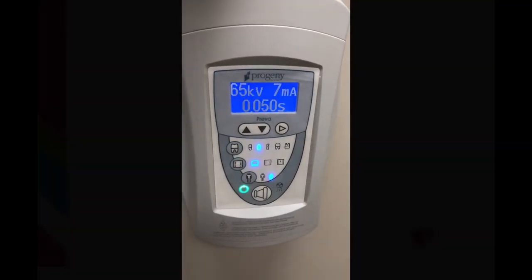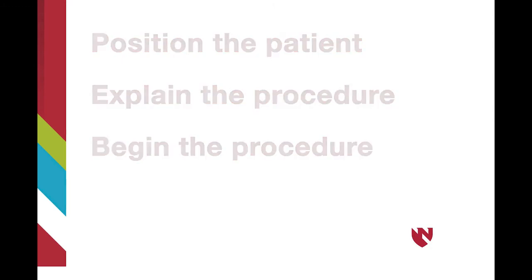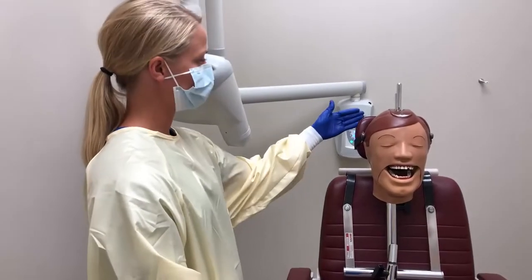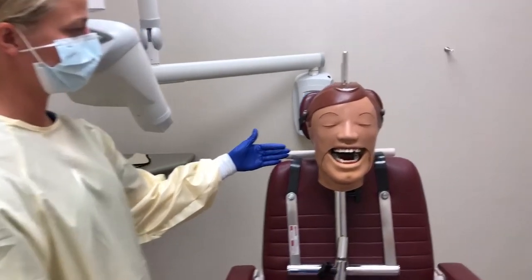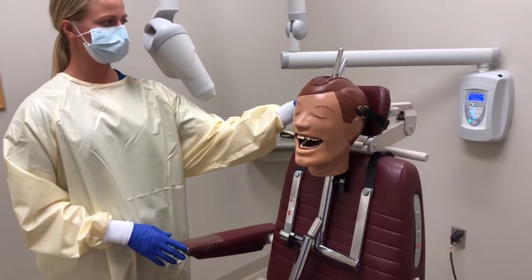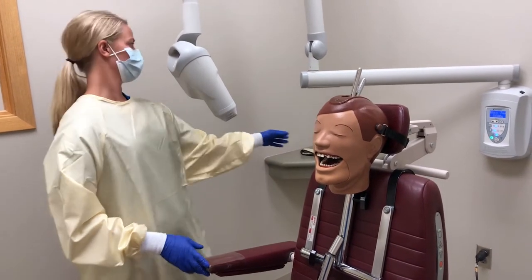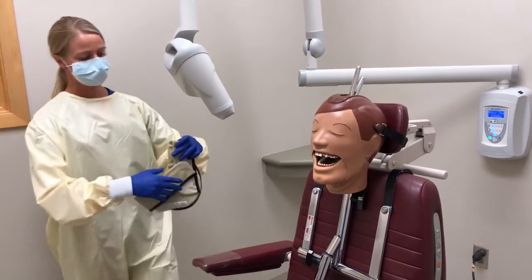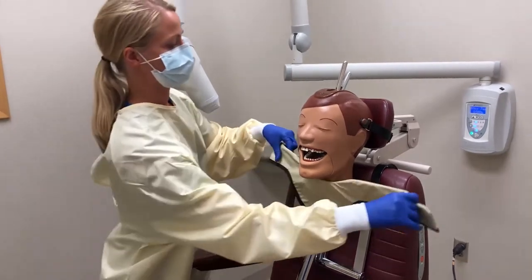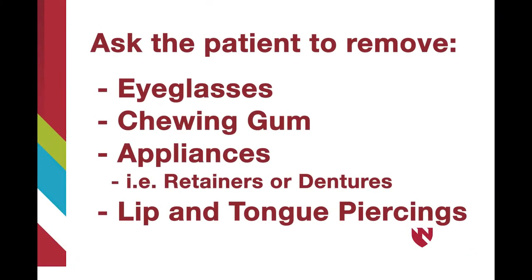Once the equipment is set up, remove gloves. Now the patient is ready to be seated. Once the patient is in the chair, explain to them the imaging process. Adjust the chair so that the patient is positioned upright and the chair is at a comfortable working height for the operator. Then adjust the headrest to support the patient's head. Once you have adjusted the patient's headrest, place the thyroid collar on the patient and secure it.